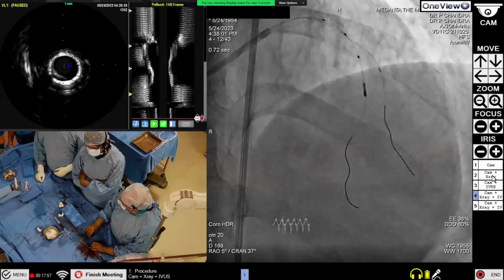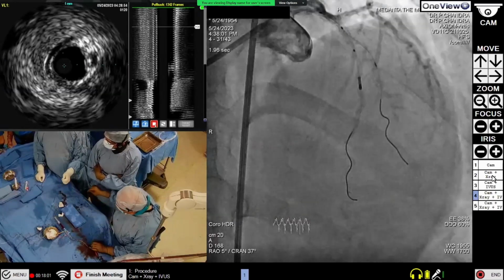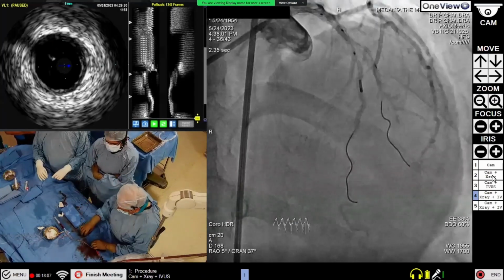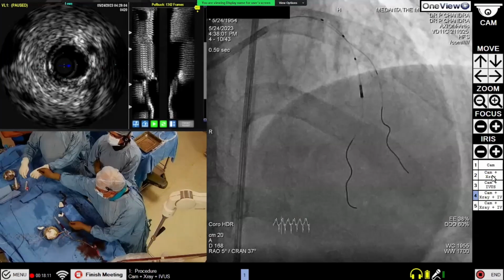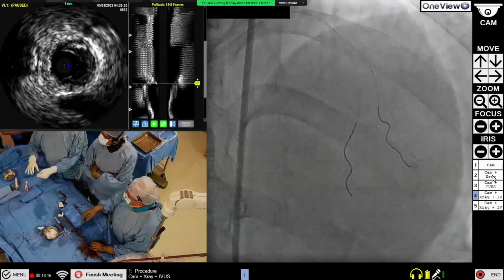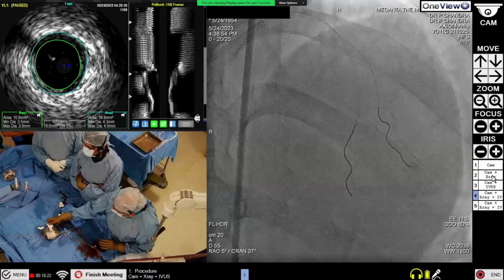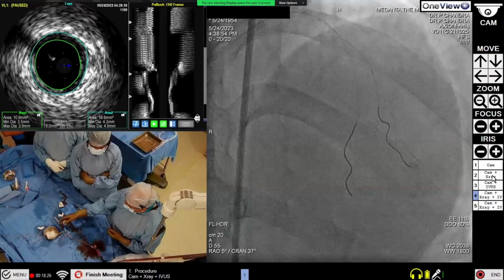If we put a stent, there are 2-3 things which can happen. The stent cannot be more than 3 mm, because the distal vessel is 3, and then we have to go up to 4, or maybe 4.5. What is the proximal LAD size? Here it is about 4 millimeters. So this will be a tapered conical stent, which may not be a great idea.